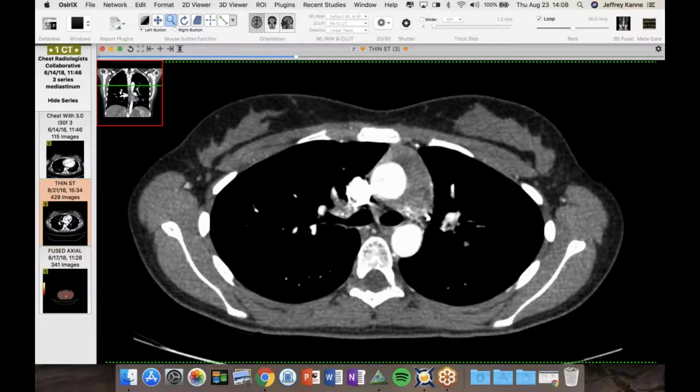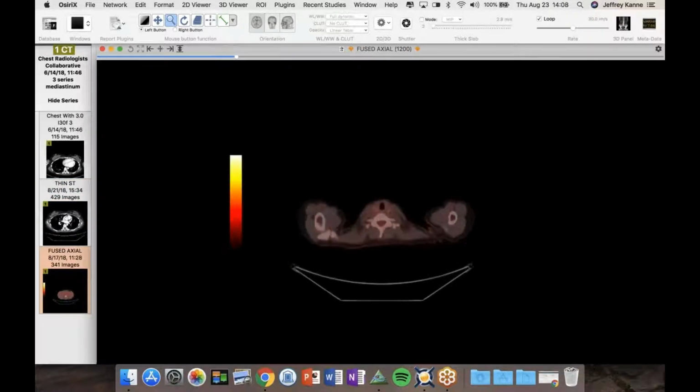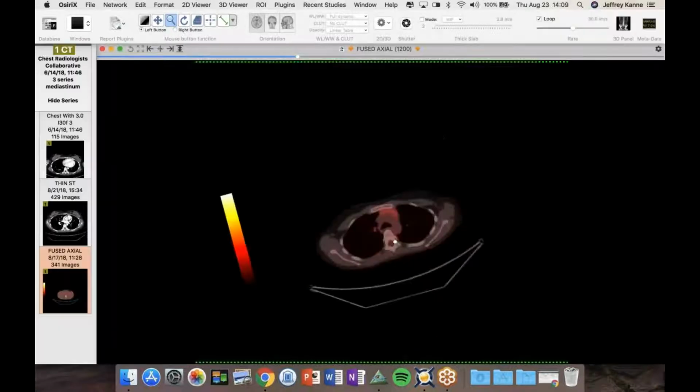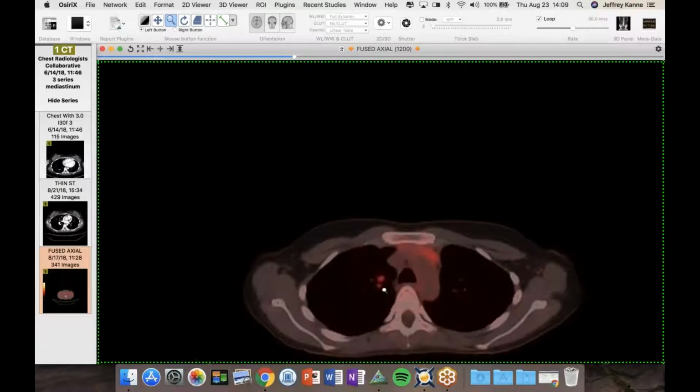You can see right here in the anterior segment, there's this soft tissue, but there's just a thread-like pulmonary artery. She had a PET scan done. Not sure exactly what the logic was, but maybe to see if there's a lot of active inflammation, and there's really just a little bit just behind the right pulmonary artery and in that right suprahilar region. Let me blow it up. I got the wrong tool here. There we go. Just a little bit of activity right up in here. Not much. And so she's been progressive. Her pulmonary function's getting worse. I don't have it loaded, but her VQ scan shows hardly any perfusion to the left lung.